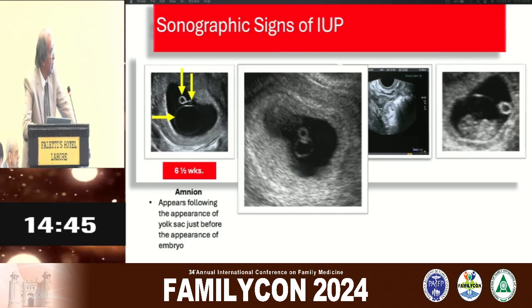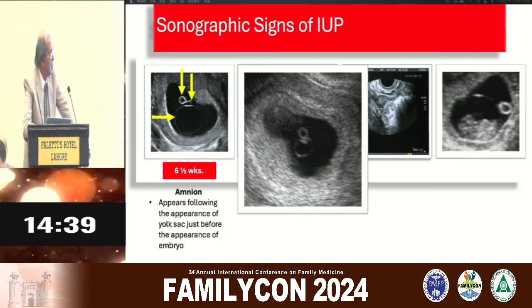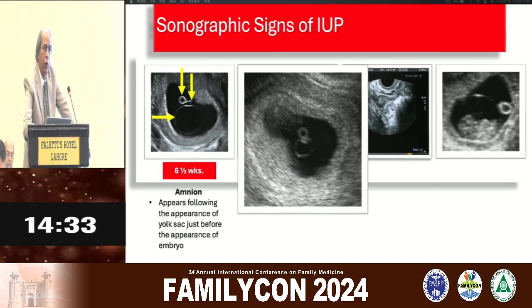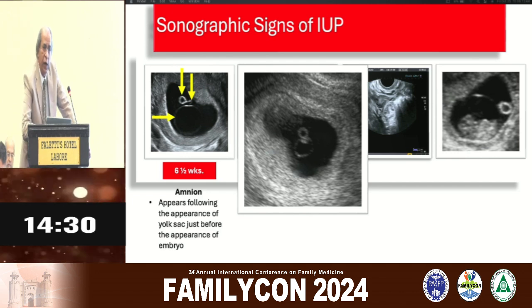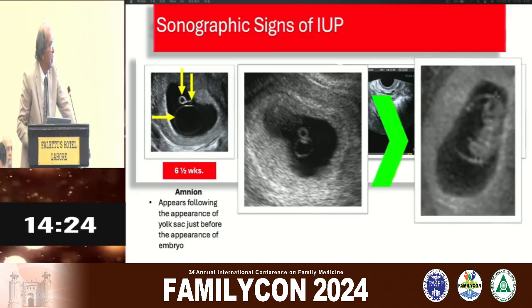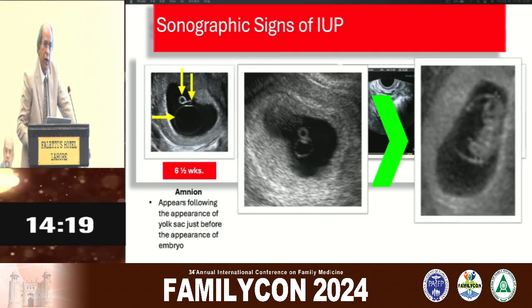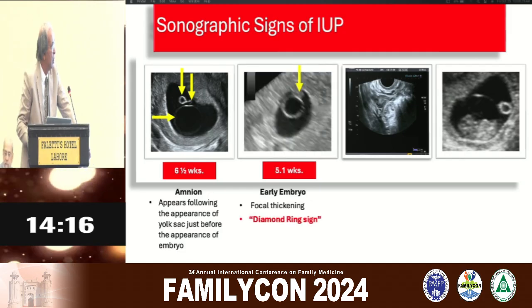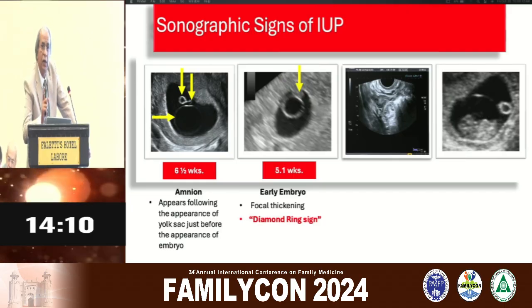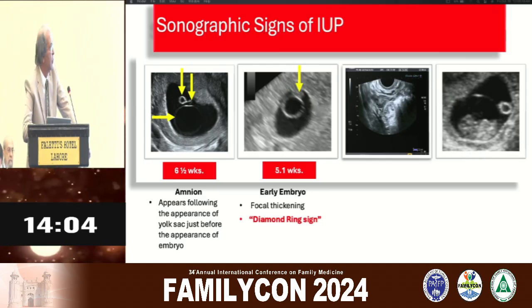But sometimes this situation happens in the pregnancy. We just see this. This is double bleb sign. This is the yolk sac. This is the amniotic cavity, and this is small embryo developing. If it is pregnancy related or not, we are to follow it up, and if it grows with this, then it is normal, otherwise it can be a failed pregnancy. Yolk sac, from that small thickening, which will be only on the one side, if it is on the other side too, then it cannot be an embryo, that will be a blood clot or something like that.